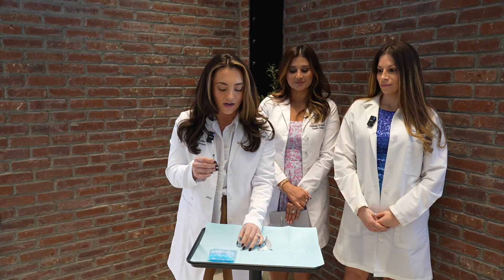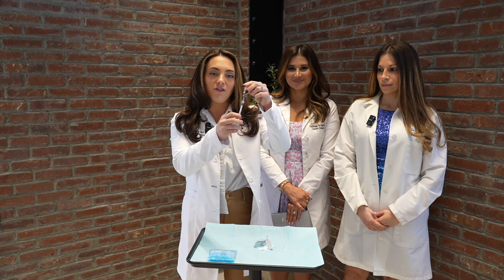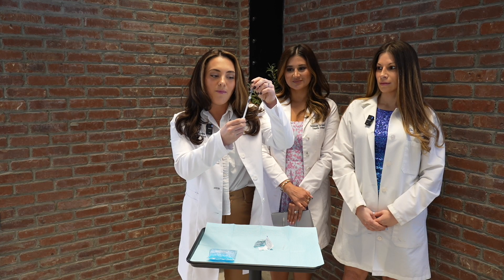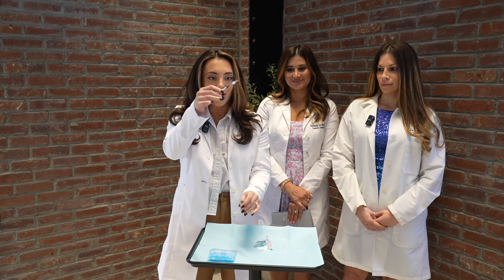Then pick up the syringe, uncap the top of the syringe, take the needle from the syringe and go right into the top of the vial, flip everything upside down, and then draw back until you hit the dose that you're designated for for the week. Then you can come out, and now we can inject.